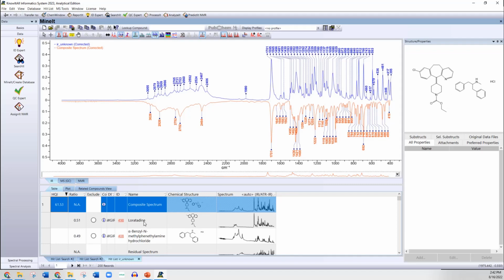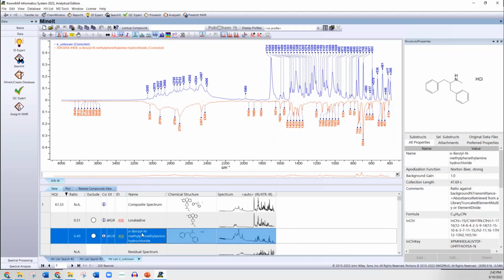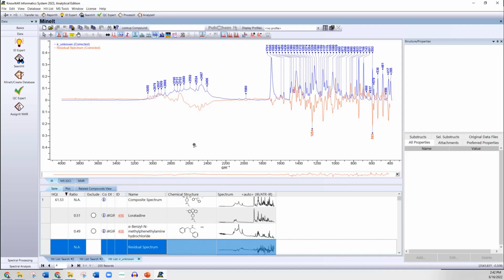But let's look at the individual spectra that it used in determining this fit. It picked this ester or carbamate here, and you can see the carbonyl frequency matches up real well in the absorption for it. And it also has some of the fine structure we expected in this part. But it doesn't really explain this large absorption here in this range in the spectrum. But if we look at the other compound it picked up, the salt, now the salt starts to explain this large lump that occurs between around 2,900 to 2,400, indicating the presence of a salt, and also some of the other frequencies down at lower frequencies confirm this. And what it's doing then, of course, is looking at the residual spectrum. It's always trying to minimize the residual left over when it assumes this is a mixture of 2 compounds.